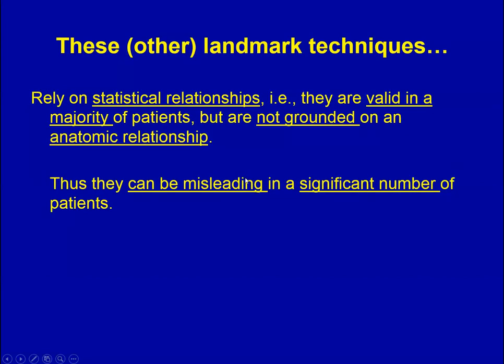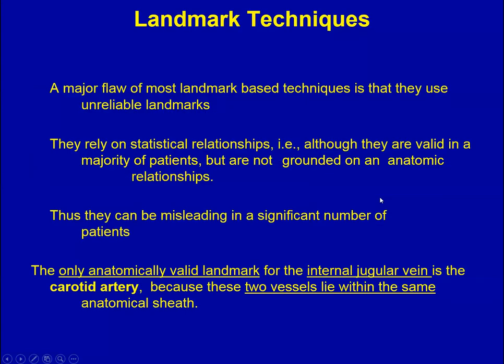Unfortunately, the flaw in these techniques is that they are based on unreliable landmarks. They rely on statistical relationships, and although they are valid in the majority of patients, they are not grounded on anatomic relationships. Thus, they can be misleading in a significant number of patients.